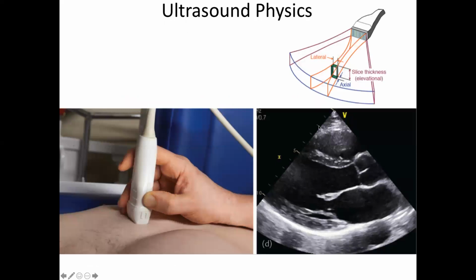And then take them to pathology and figure out what kind of tumor you have. So here's a diagram of the transducer itself, just to get the coordinates. As we saw in a bunch of these, in this case there's a linear array of these crystals. They're usually ceramic. Just to get our coordinates right, this is called the lateral resolution in this direction. Axial in this direction is the depth resolution. And then slice thickness is in this direction, or elevation, right?